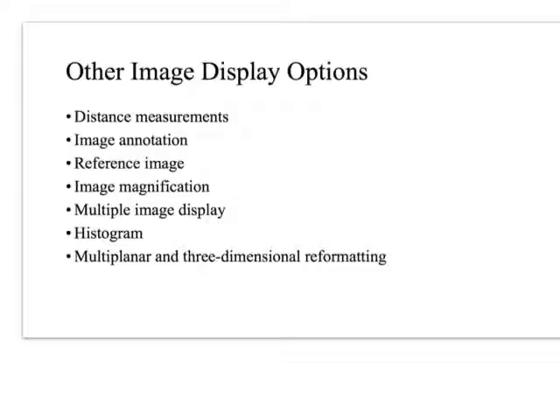And one of the things that she's talking about, and one of the ways that we use histograms is, and we'll talk about this more in the summer, but if we're measuring contrast and how it perfuses, we can set an ROI, measure the histogram, and when it gets to a certain spike, we can initiate the scan. Okay, and I know I just threw a whole bunch of gobbledygook at you, but just understand that these histograms we can use to sample things in real time.